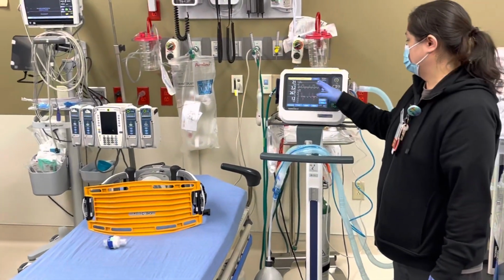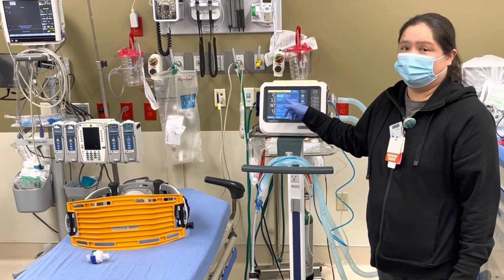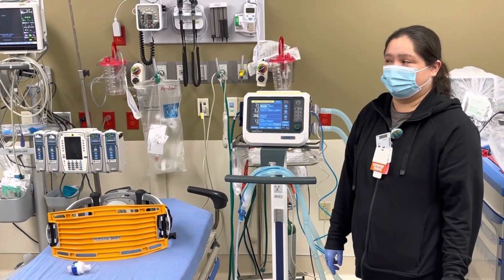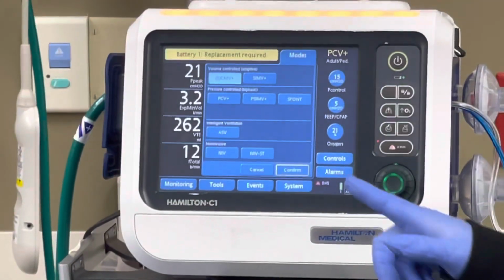So in that case, if you have an intubated patient, it's most likely going to be CMV. We're not going to want them breathing on their own, because they're usually paralyzed, so strictly CMV.